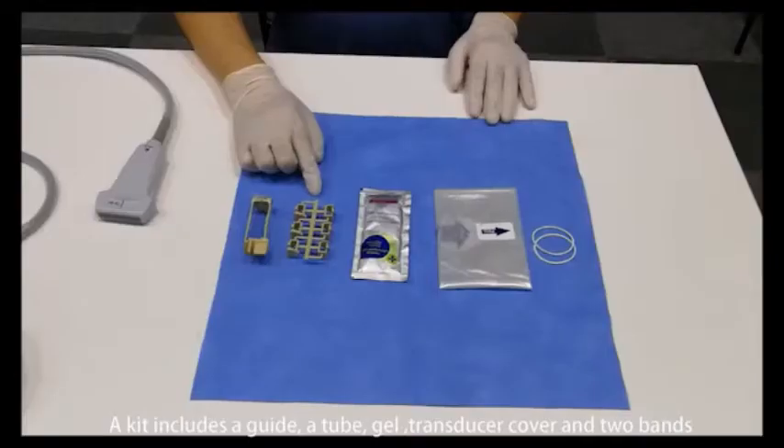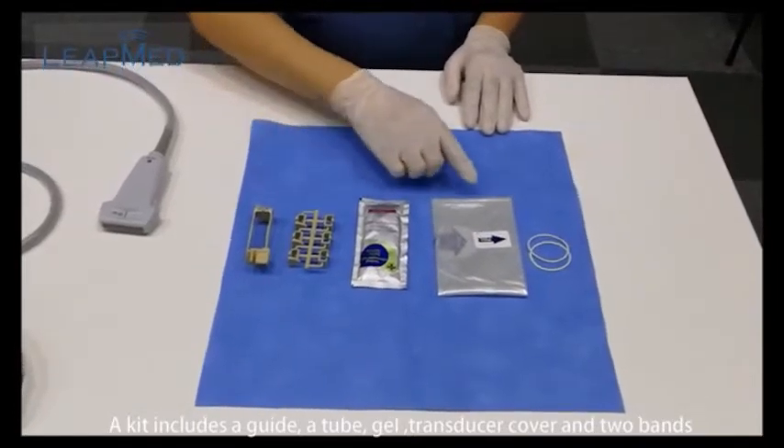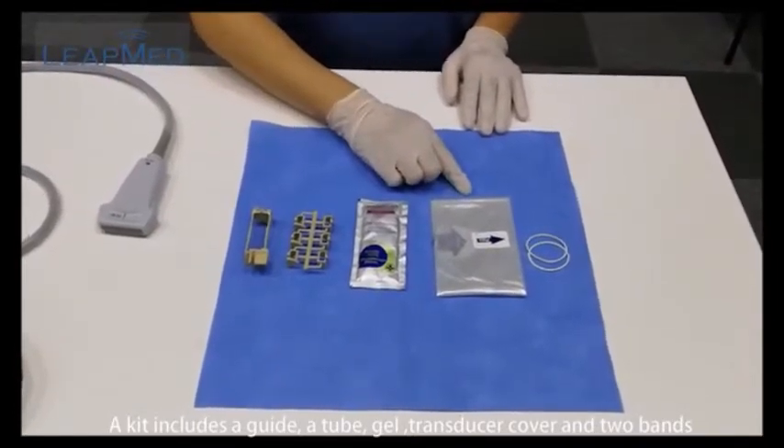Disposable biopsy guiders. A kit includes a guide, tube, gel, transducer cover, and two bands.